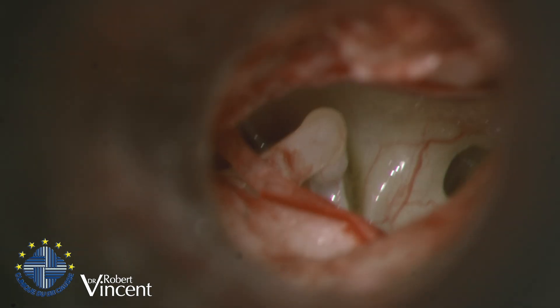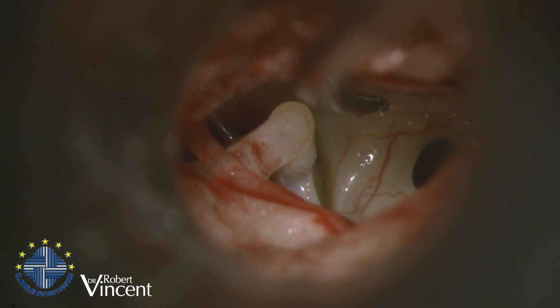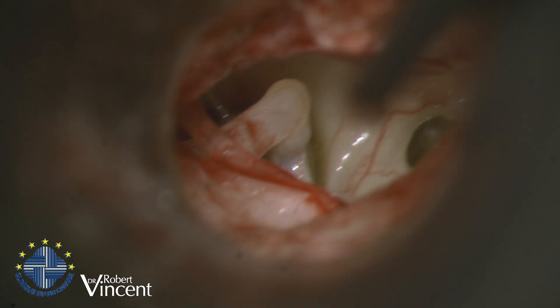What we see here is the incus, the head of the stapes, what we call the promontory which is there, and the round window which is here — so the round window is at this level.